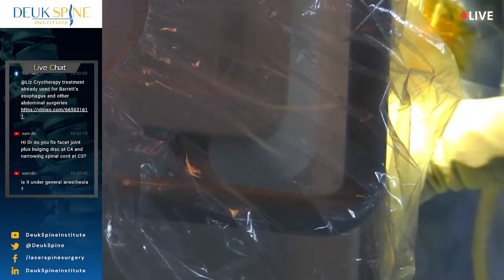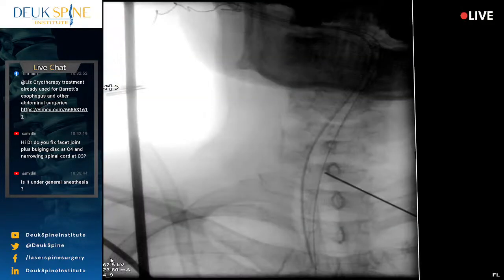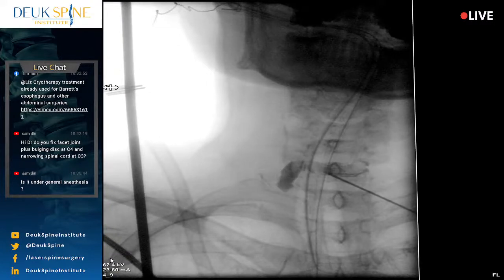All right. Let me just see here. I want to make absolutely sure we're good. I know we're in deep enough, and let's just do a discogram while I've got you here. Let's do the AP part, and then you can go back to a lateral and just stay there. So we do a discogram in this case for the purpose of identifying tears in the disc. And you can actually see the tear back there, lateral.